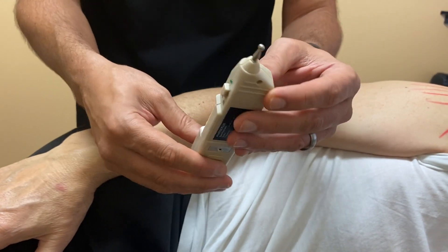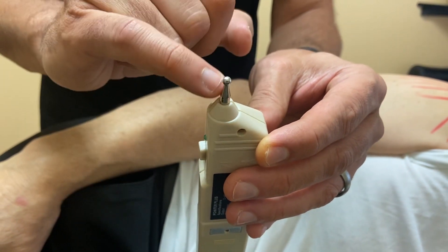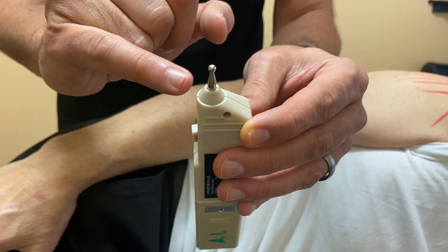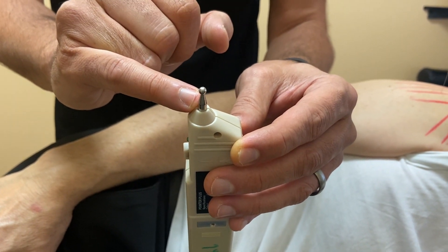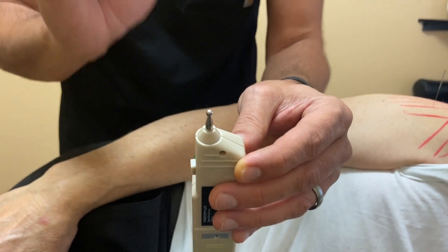Before we stimulate, make sure that the ball at the end of the pointer plus is the bigger ball. This is important because it can hook onto the needle and not slip off. It usually comes with a smaller ball, so look for that.